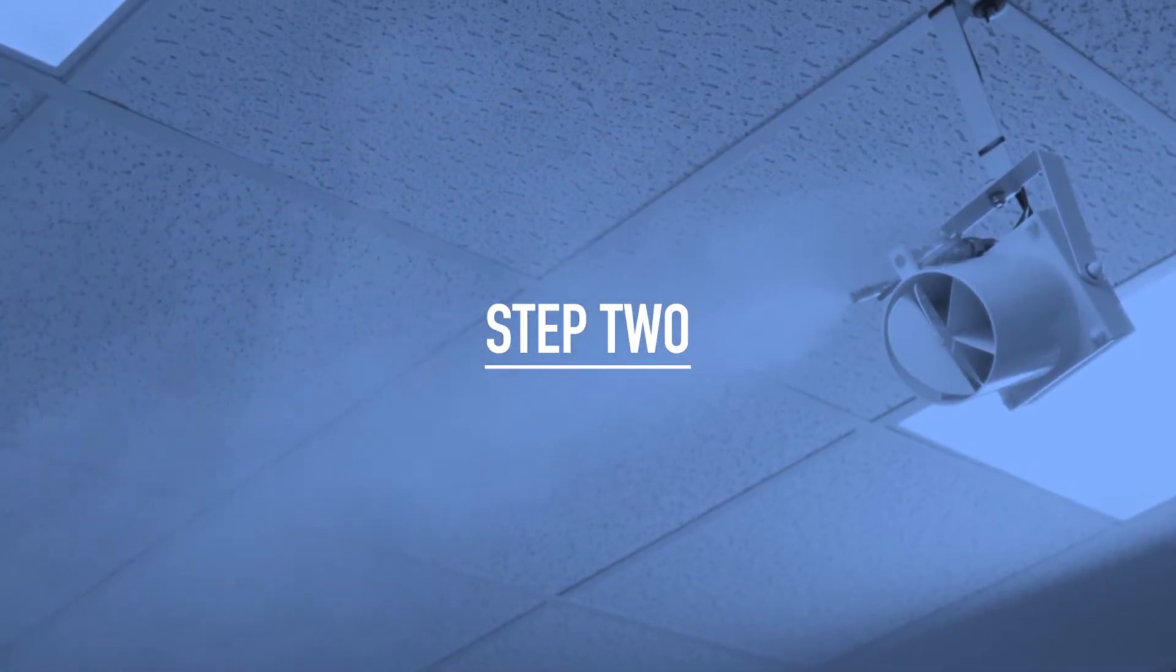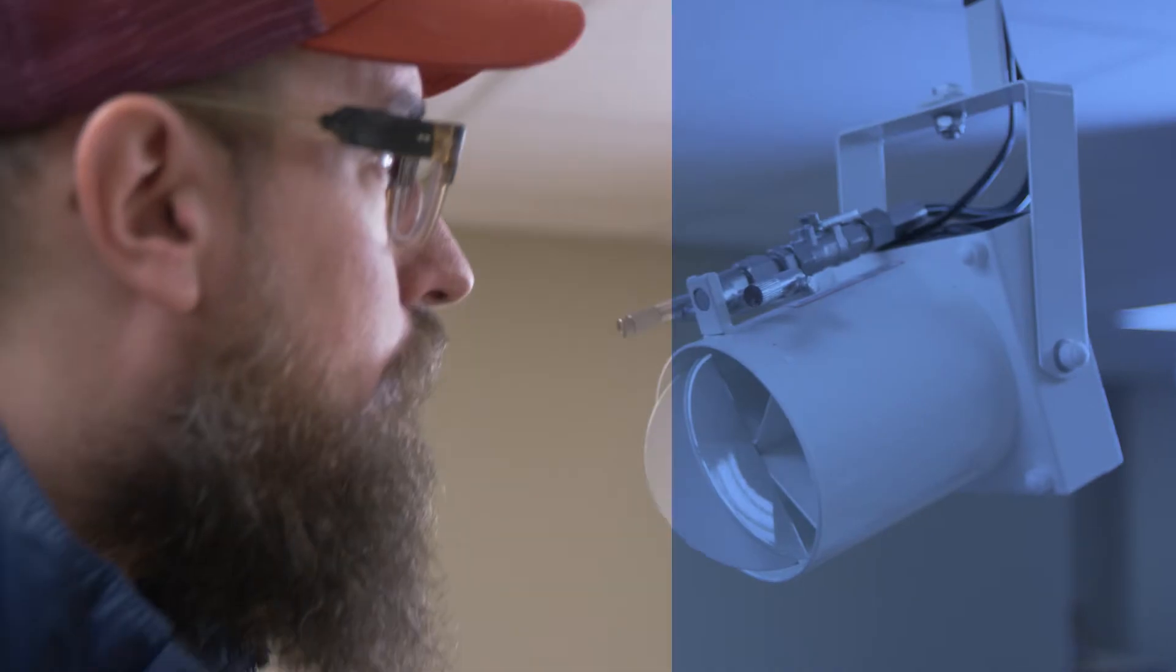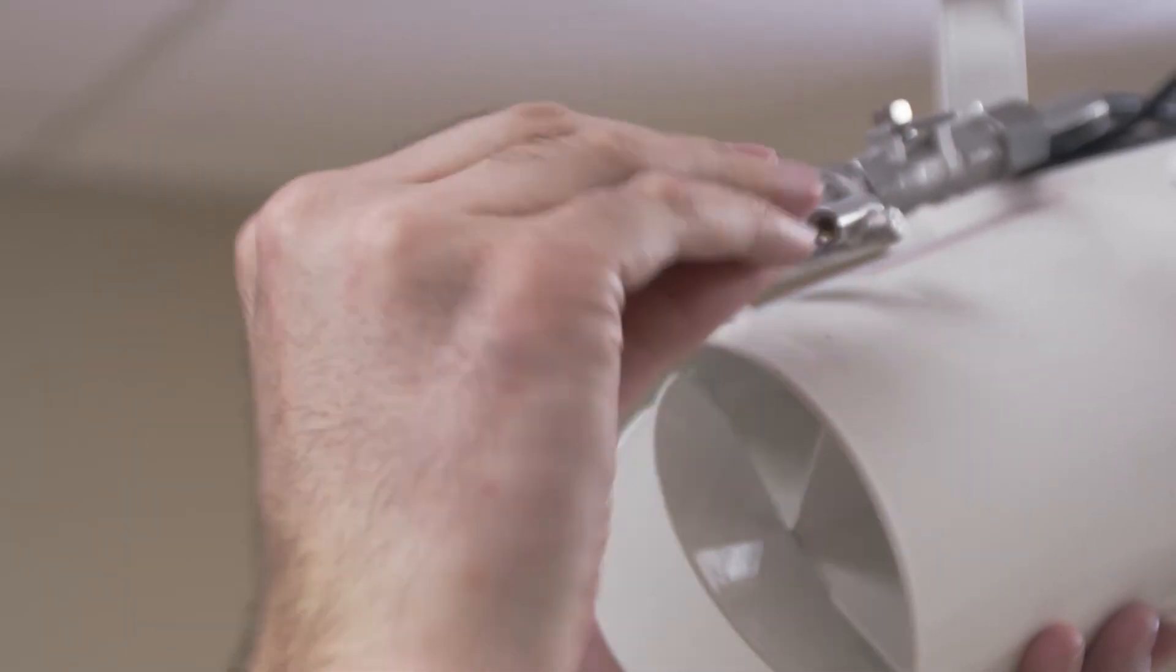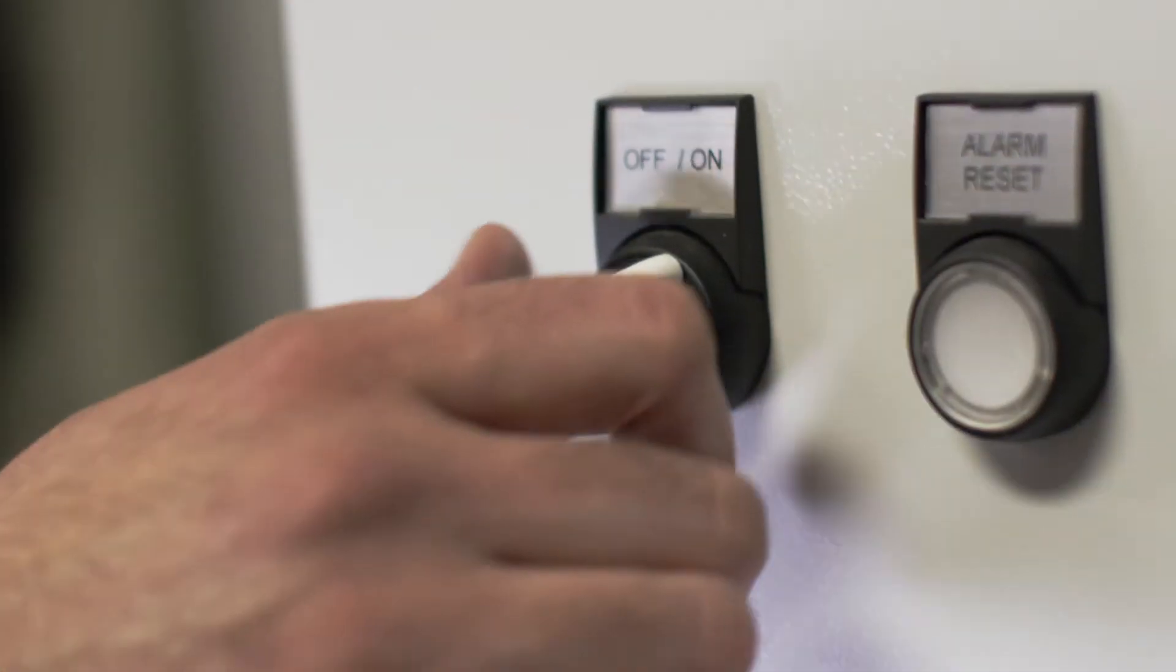Next, locate the source of your water sample. If you're sampling from a nozzle, first close the valve so you can remove the spray head. If you're sampling from a pump, shut it off.